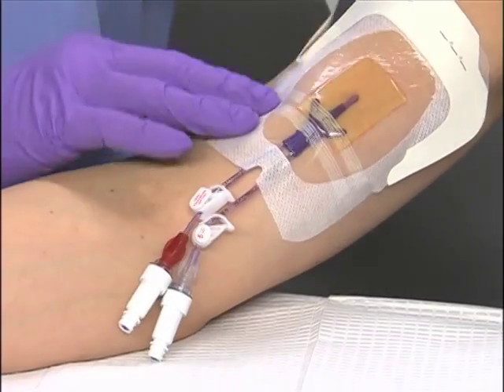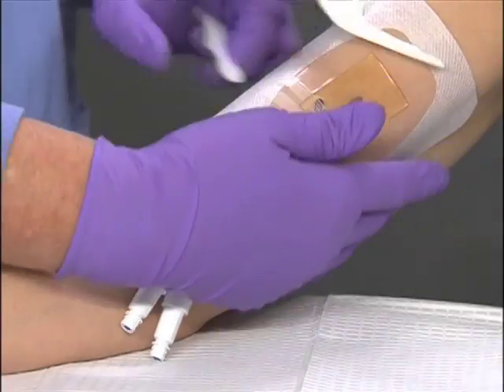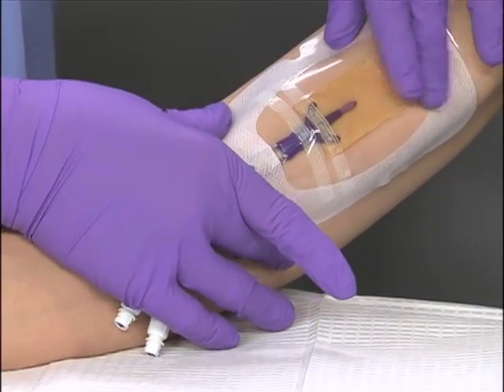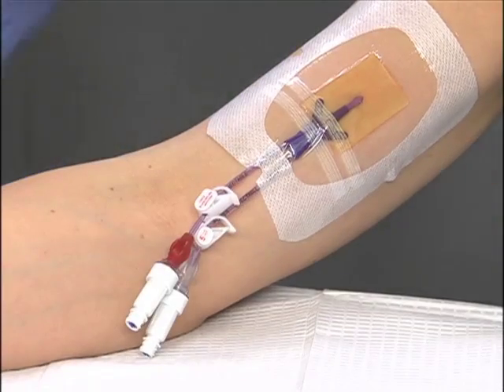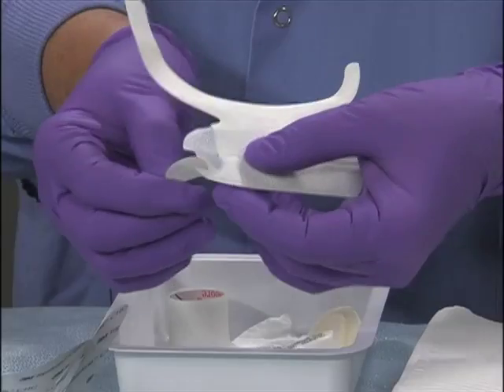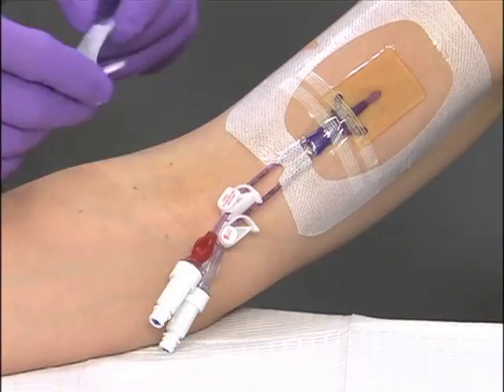When firm pressure is applied to the adhesive film, a greater amount of adhesive is pushed into the valleys or nooks and crannies of the skin surface, thus allowing more adhesive to be in contact with a greater amount of skin surface and providing better overall adhesion of the dressing. With the heat of the body, the Tegaderm CHG gel pad conforms around the catheter. Remove the pre-cut sterile tape strip from the paper frame. The 1658 dressing includes one notched tape strip.